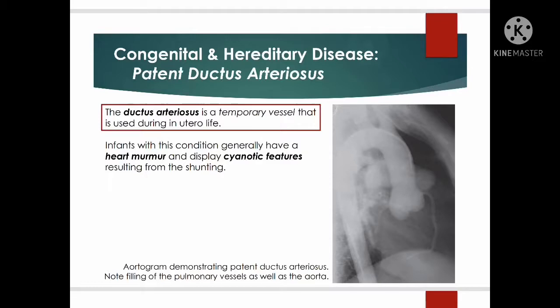A normal measurement is 0.42 to 0.50. If the measurement is less than 0.42, it is pathologic, while if it is greater than 0.5, it is considered cardiomegaly. The treatment for patent ductus arteriosus includes fluid restriction and diuresis, use of drugs, and surgical intervention.